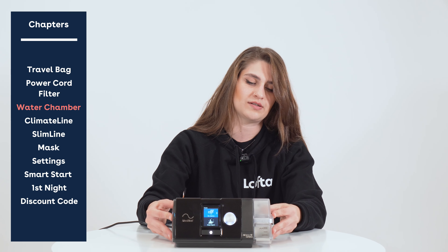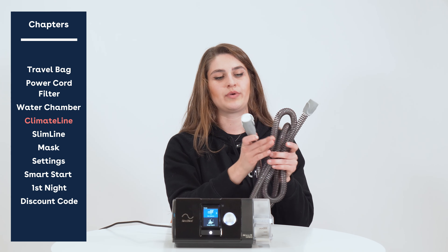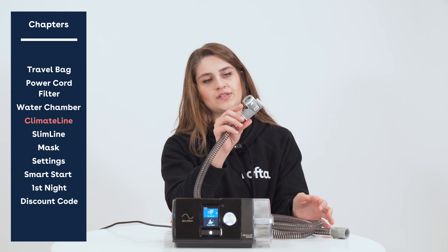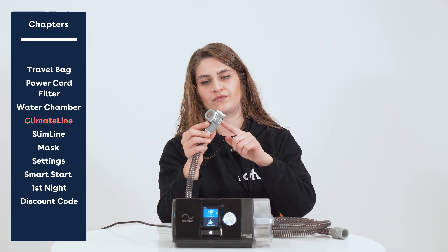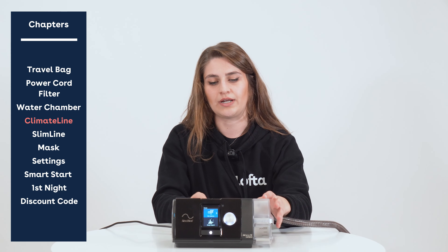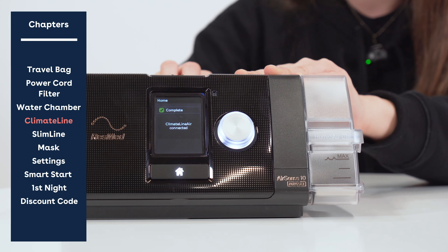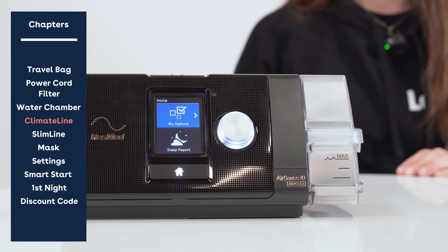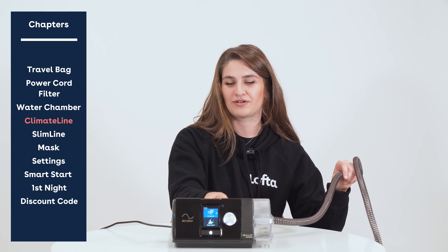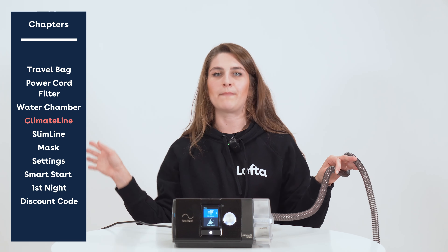If you can wiggle the water chamber around, it's not in all the way. Now if you ordered the climate line heated tubing, it's going to be specifically inserted into the back of your unit. There's a tiny electrical chip that goes into the air outlet at the back of the device so the device will know you have heated tubing connected — it should also click into place and you should see the words 'ClimateLineAir connected' populate on your screen. It has a little swivel so you can have your device on either side of your bed without issues with the tubing.